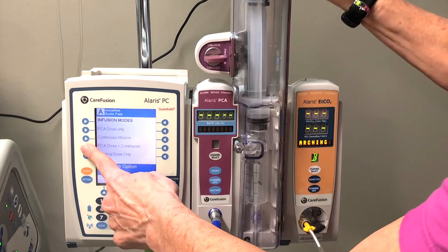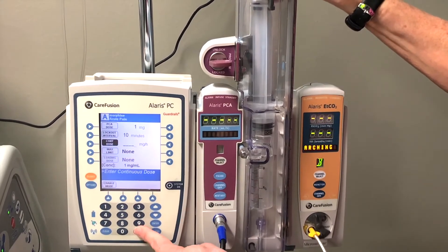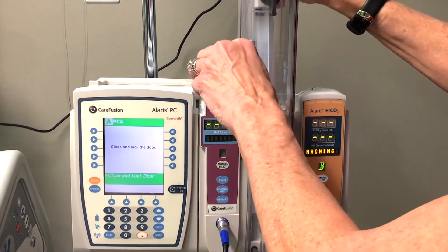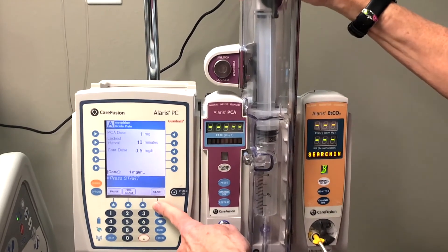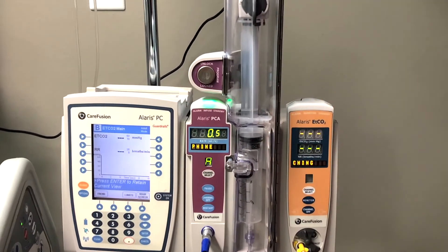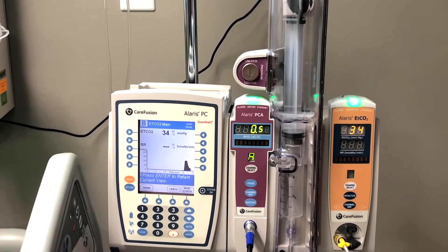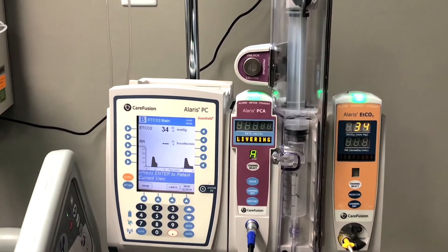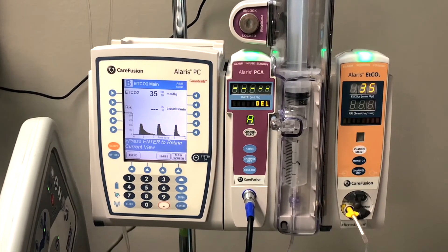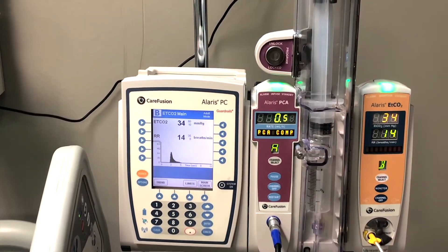This order is PCA dose plus continuous. We're going to do a dose of one, a lockout of ten, a continuous dose of 0.5. We're not going to do a max or a load on this order. We're going to press confirm, close and lock the door, press start, and then our patient will display what we call a capnograph so that we can watch their respiratory and their CO2 rates as the narcotic is on board. There's a dose available, so I'm going to go ahead and push that. And now we can watch our capnograph as our patient receives the medication.